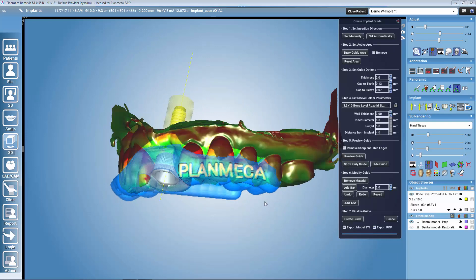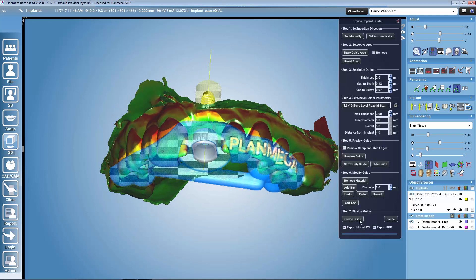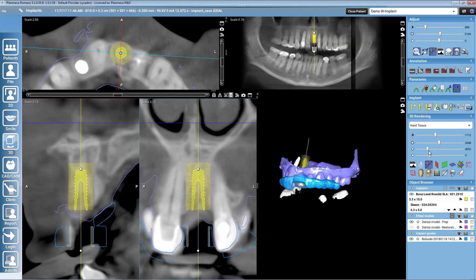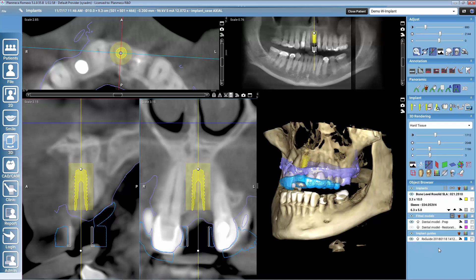Then we are ready to create the actual guide. Romexis will create the STL file for the guide, which will also be exported at the same time to your selected location. You will also be able to create an implant report. After creating the guide, it will be visible in the patient data and can be managed from the object browser. You then bring it to any 3D printer and print it with the surgical guide compatible material. That easy to create your own guides locally. Thank you very much for listening, bye-bye.